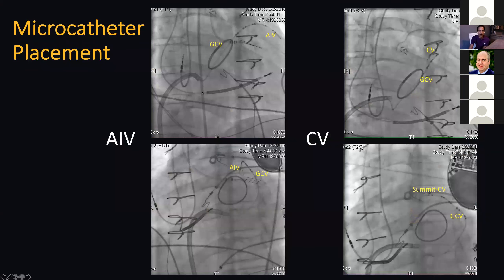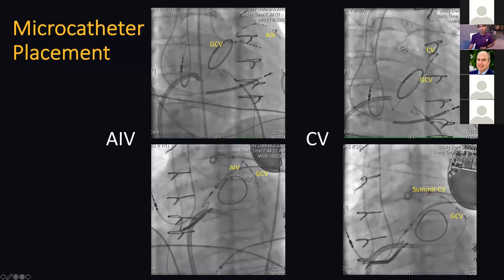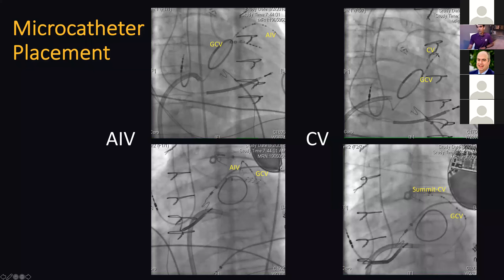I use something called the MAPIT catheter, which comes with either 10 or 20 electrodes. This is an RAO view showing the MAPIT catheter in the anterior interventricular vein — the AIV — with an HD grid catheter sitting right underneath it. In the LAO view, the MAPIT catheter goes into the communicating branch, going septal instead of straight down. This is where the epicardial LV summit is, and it allows you to take recordings from there. You still need to do a coronary angiogram — in this case we were right on top of the LAD and not able to ablate.